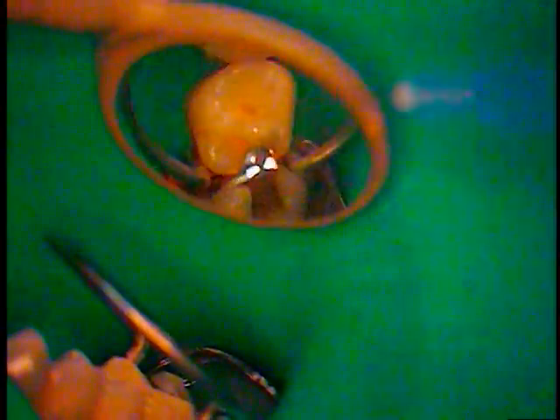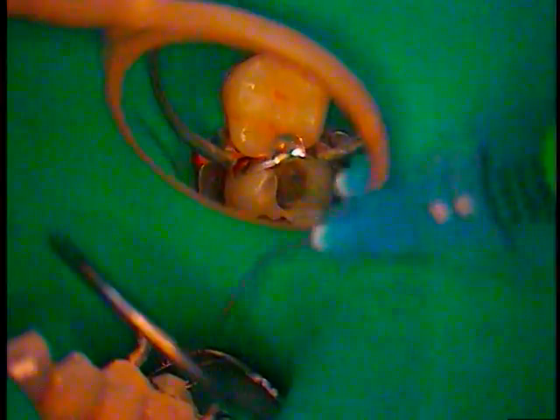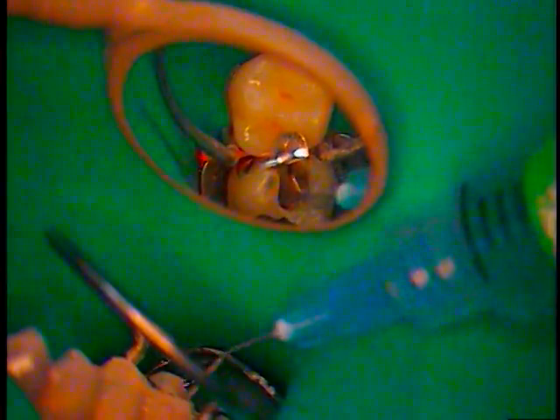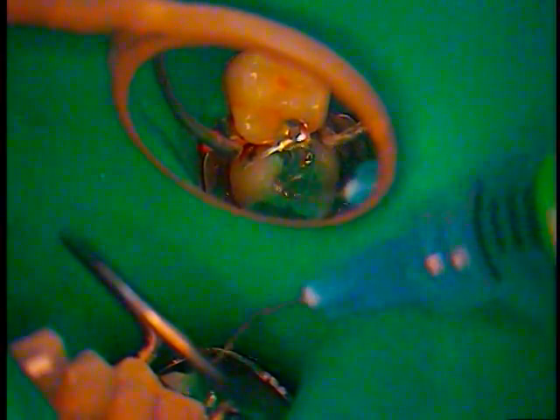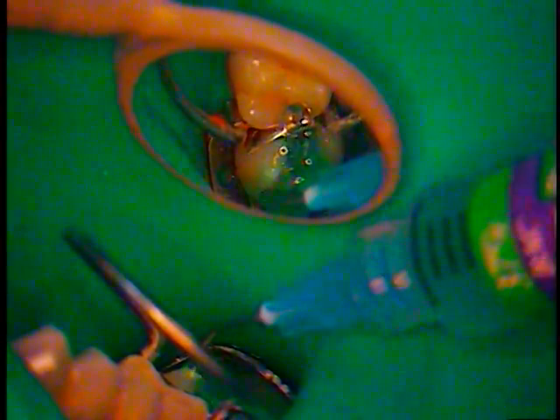Okay, and we'll go ahead and rinse that. Just the bicuspids. That's all. I'm gonna go ahead and add this suction only, add to the molar. This is total etch. Give it 15.